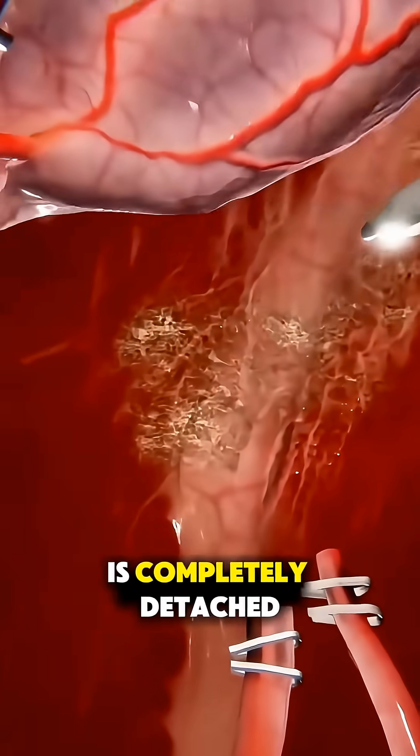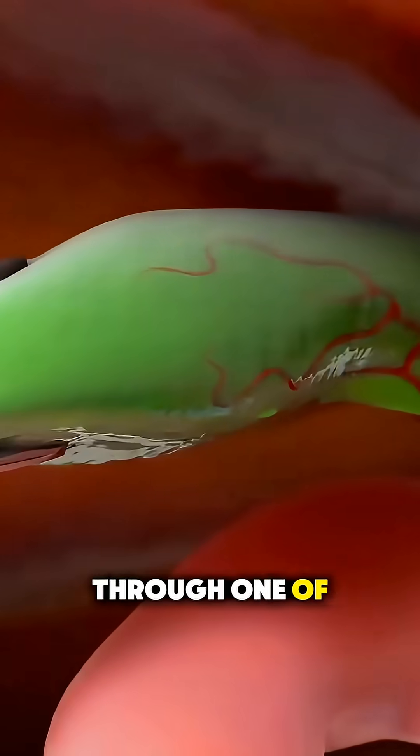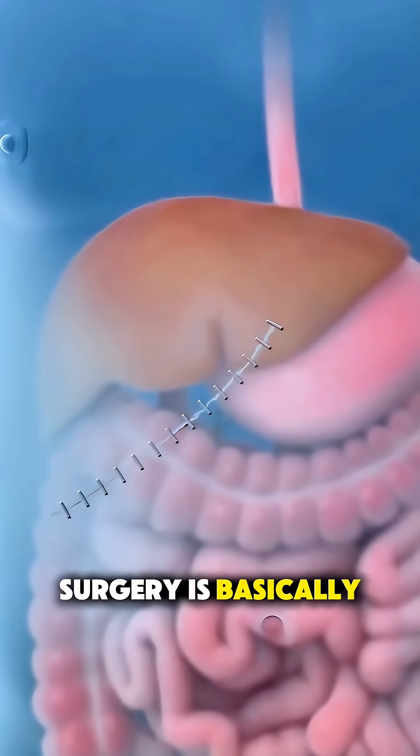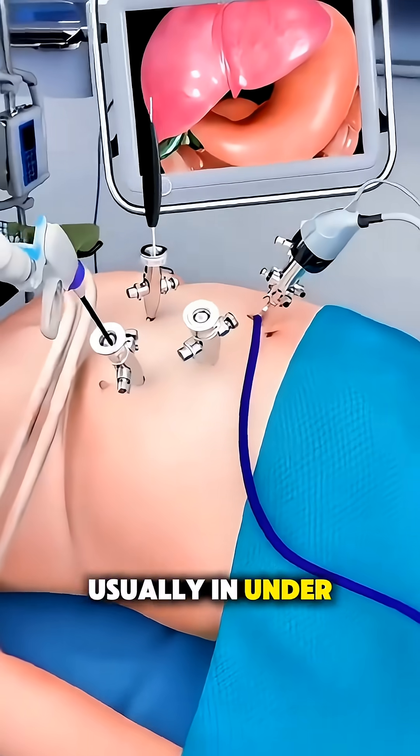When the gallbladder is completely detached, they remove it through one of the tiny incisions. After that, they let out the gas, close the small cuts, and the surgery is basically done, usually in under an hour.